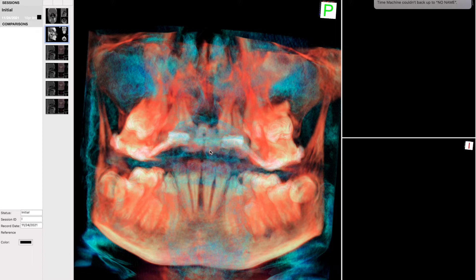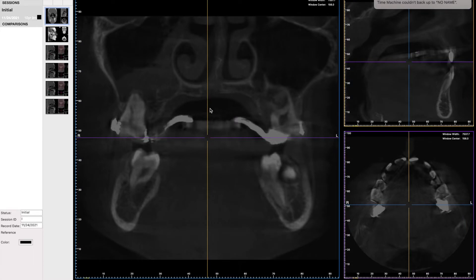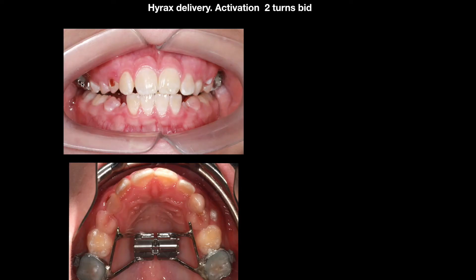I'm going to hold this appliance for another six months to let the bone grow in between the two maxillary halves. I'll show you the amount of opening here — this is the clinical representation of the same patient.